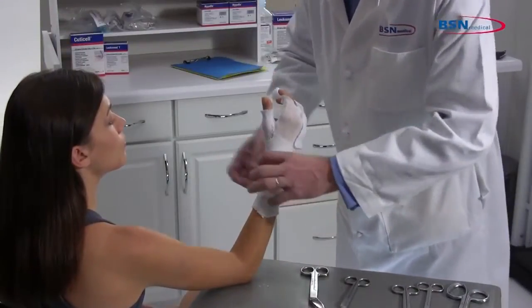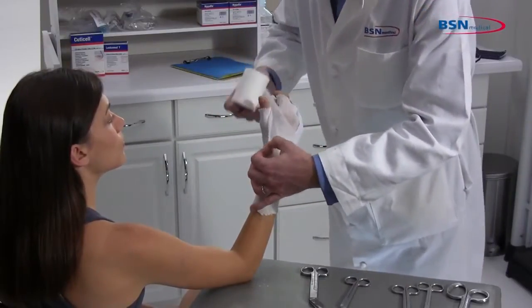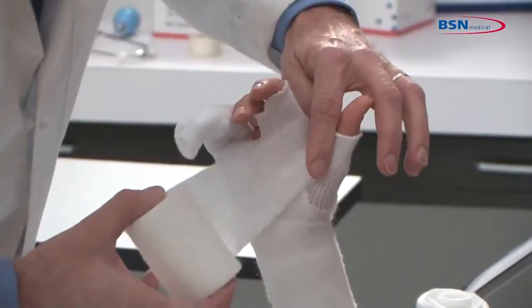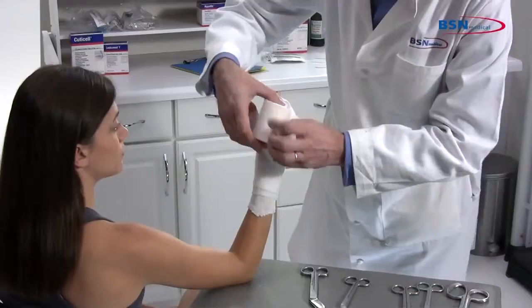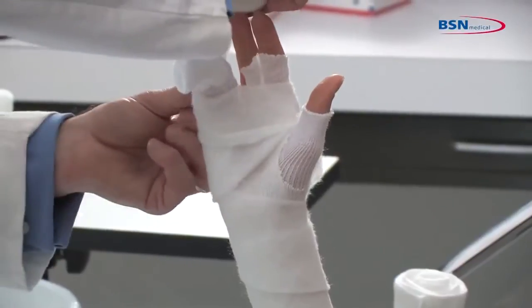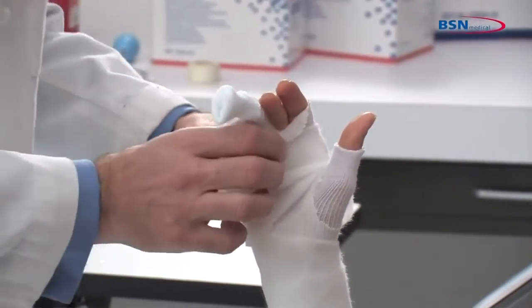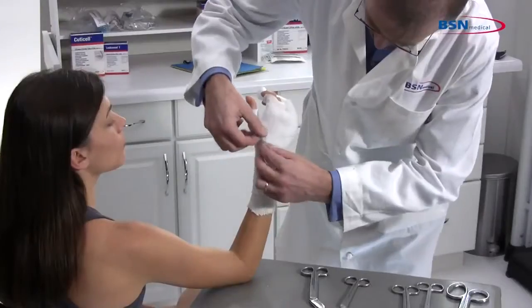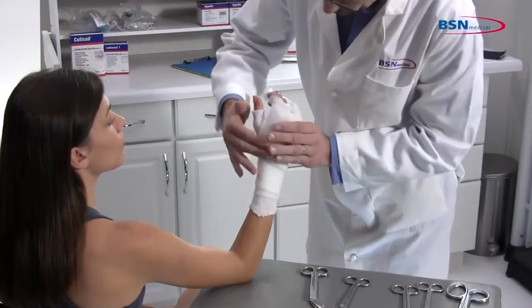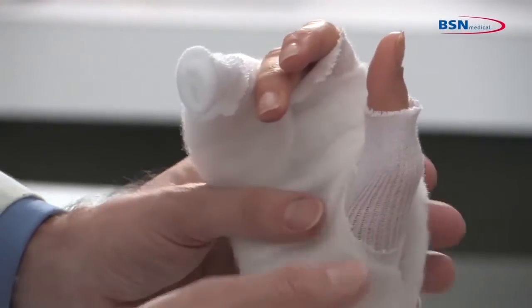Apply two-inch or three-inch padding starting below the wrist, going through the webspace twice, and around the fourth and fifth phalange. Applying with a slight tension will allow the padding to lie down smoothly and have a snug fit. Additional padding may be required for bony prominences.